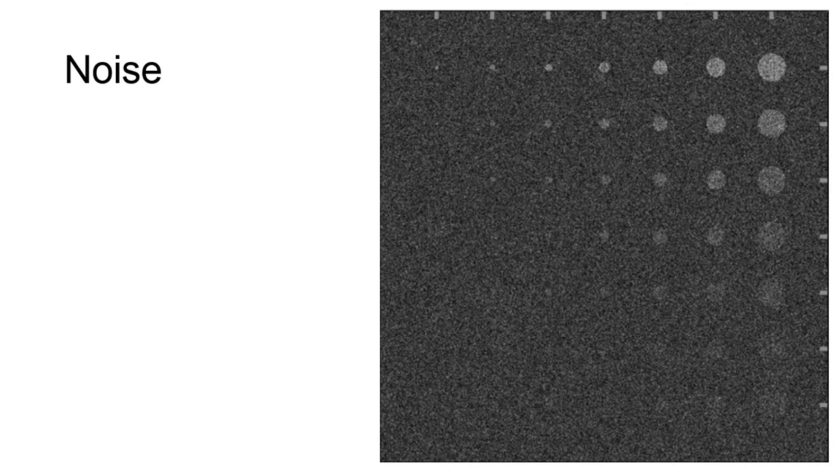As your textbook states, there are no quantified guidelines for acceptable levels of noise in the electronic radiographic images yet. The AAPM made a test pattern available for monitoring noise levels over time, consisting of a series of circular areas within a black mask which gradually increase in brightness as they progress diagonally across a small square section of the screen.